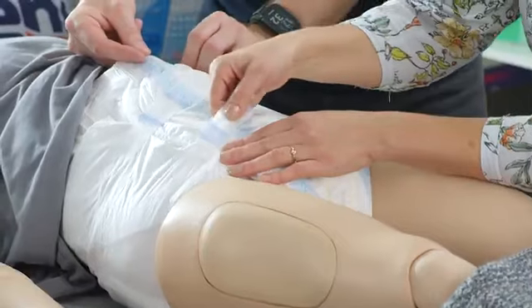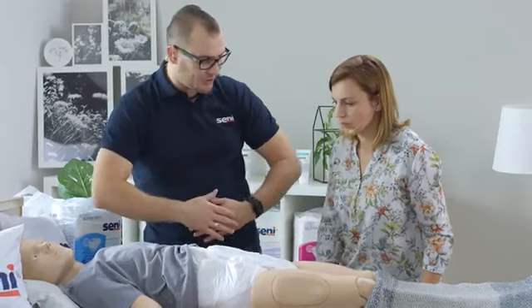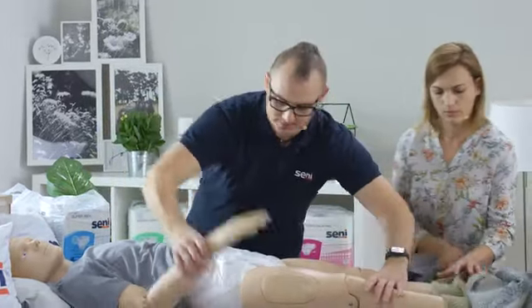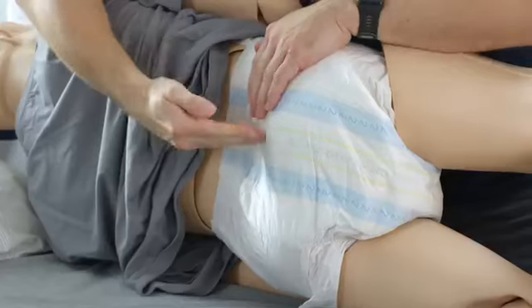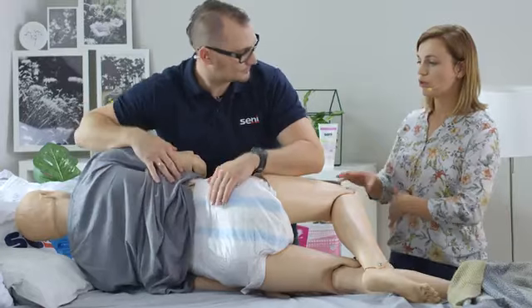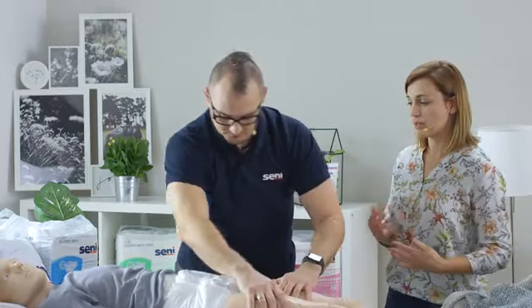These elastic combi tapes stretch very well, but they still return to the same place. Exactly. We have an elastic waistband in the front part, which also closes the product very well, and it is very convenient for the patient. And now I will even turn our patient on his back to show you that you also have such an elastic element in the back, ensuring protection against leaks on the back. So on one hand, the product adapts perfectly to the body, even when you change position. And on the other hand, it protects you perfectly against any leakage.